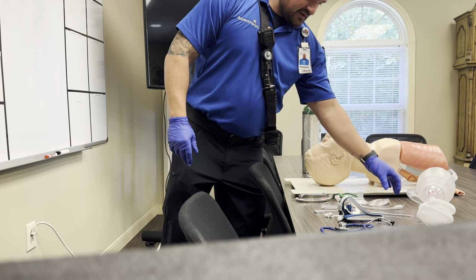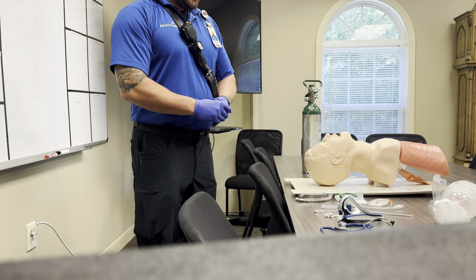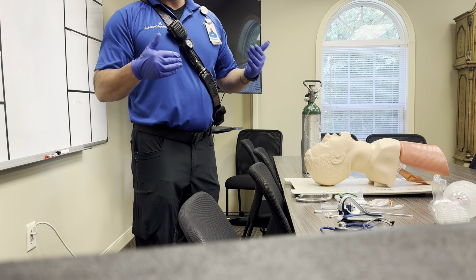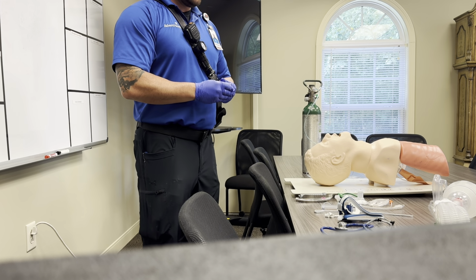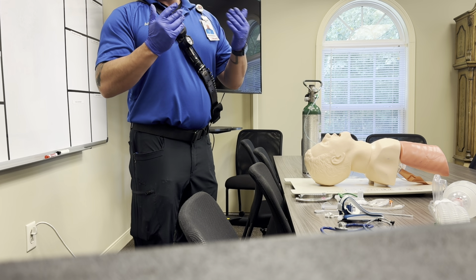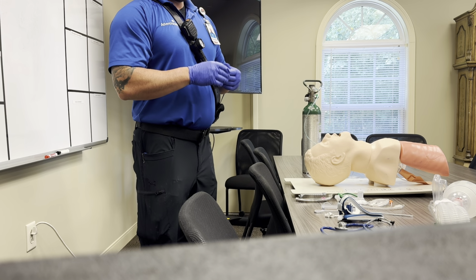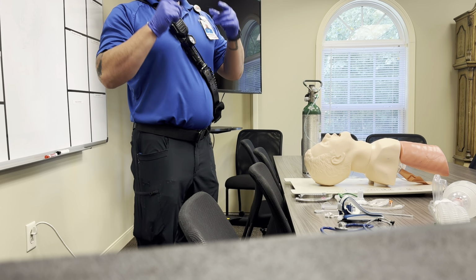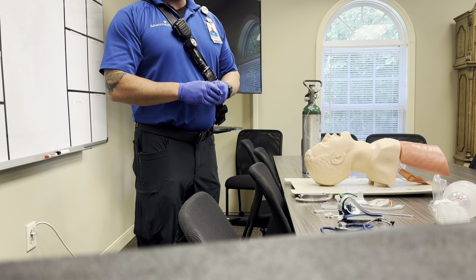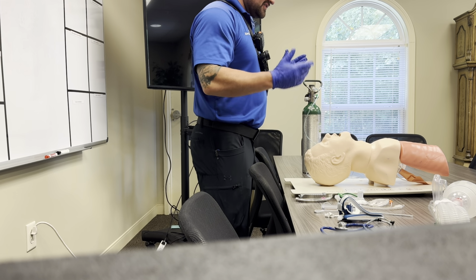So now, to begin our intubation, we know that we have all of our equipment laid out that we're gonna need. We have our patient, our mannequin. Obviously I already have my gloves on, but first and foremost, just like you're taught in every EMT paramedic school, BSI, scene safe. We know our scene safe. Obviously I have my appropriate PPE on. A lot of services that I know of now, they're going to safety glasses. So you need to wear safety glasses if that is one of your SOPs for intubation. It's not in our case, but this is the first thing we want to do.